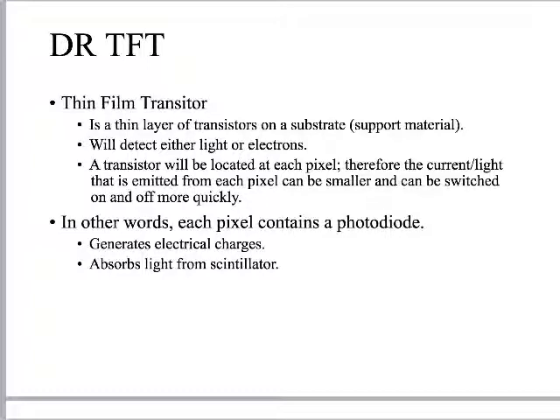Once it registers that hit, it assigns it a value and a pixel location. So our TFT system, this substrate, this dynamic array, computes exactly to pixel size. So these things are super tiny. In other words, each pixel contains a photodiode, right? It generates electrical charges and it absorbs light either from a scintillator or absorbs the X-ray image, the X-ray information directly.